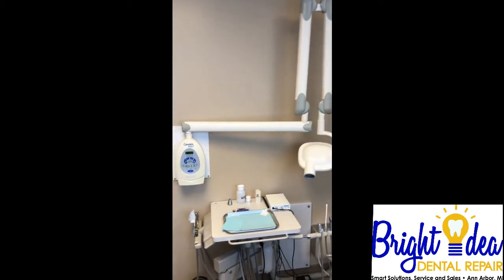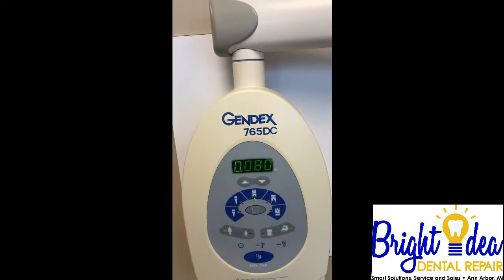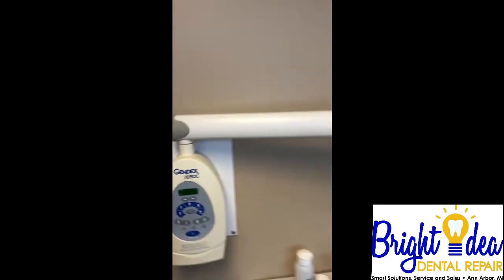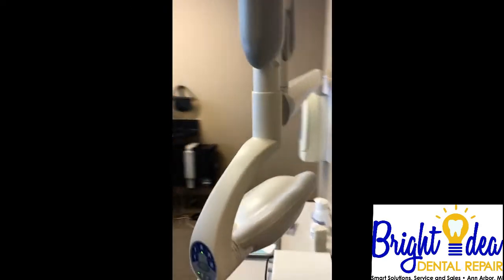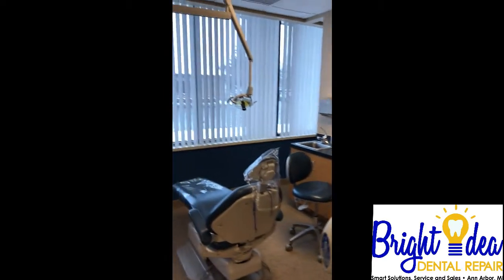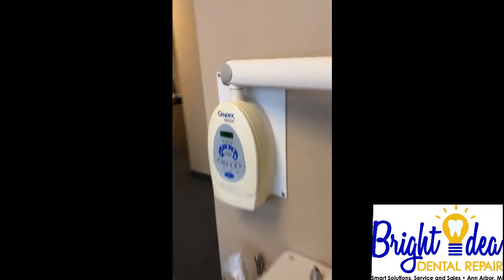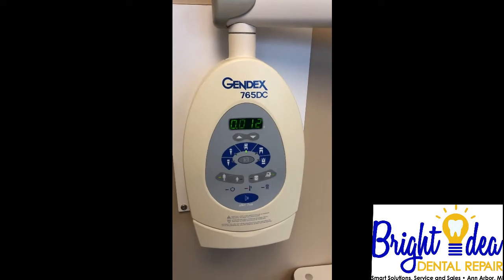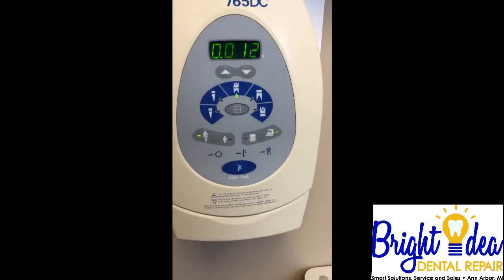We have a Gendex 765DC that is being set at 80 milliseconds, and when the exposure is pushed you get a strange noise — it goes down to 12. It does this every time. What we're going to attempt is to replace the capacitors on the board. We also have an over-temp indication.